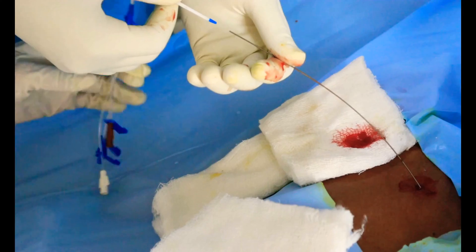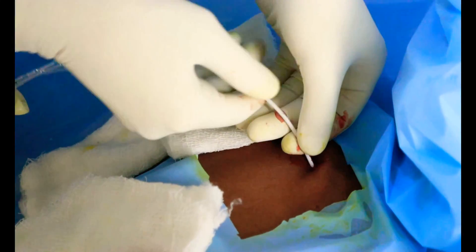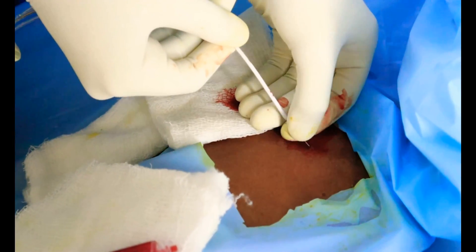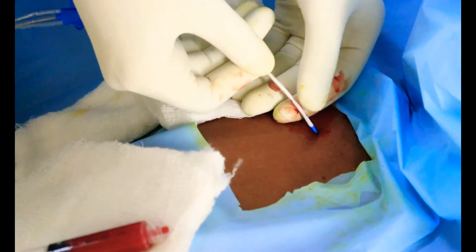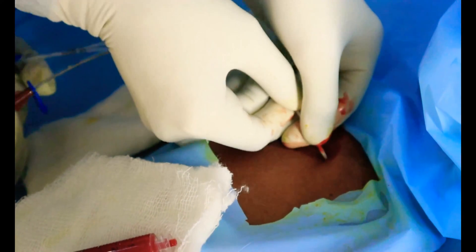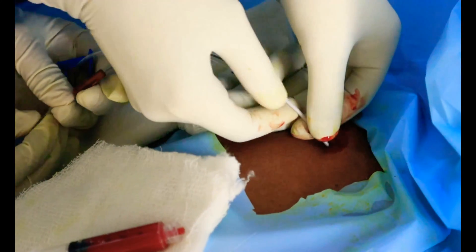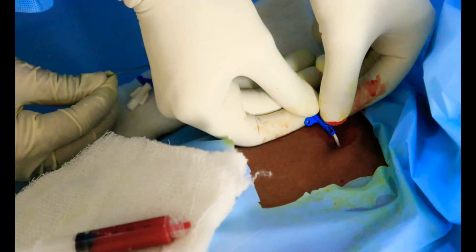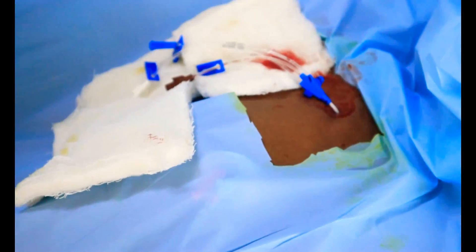After the distal port of the catheter is open, pass the catheter over the guide wire. When the catheter is near the entry site, feed the guide wire out until it emerges from the distal port, and insert the catheter to the desired depth — here, fifteen to sixteen centimeters from the right clavicle. Now hold the catheter in place and withdraw the guide wire, ensuring that the guide wire is intact until it is completely removed.